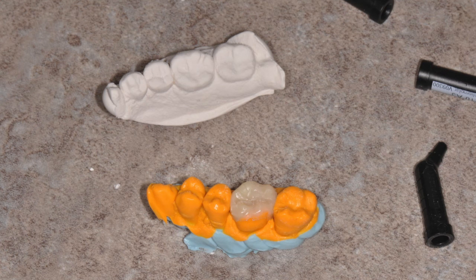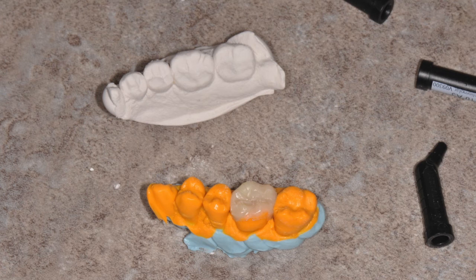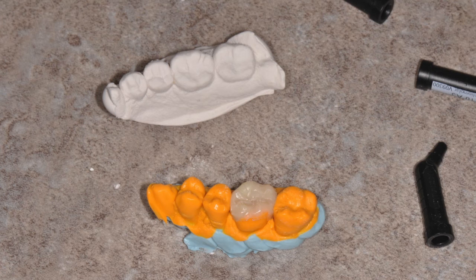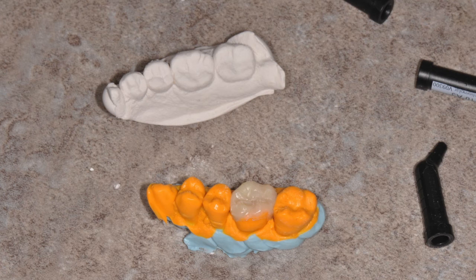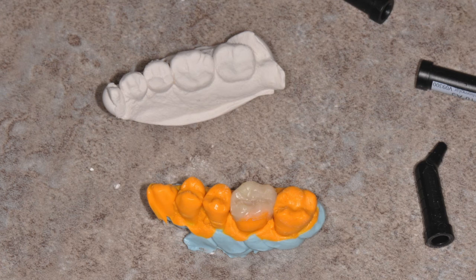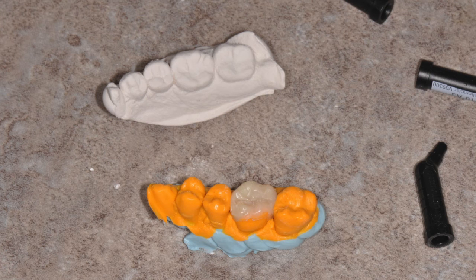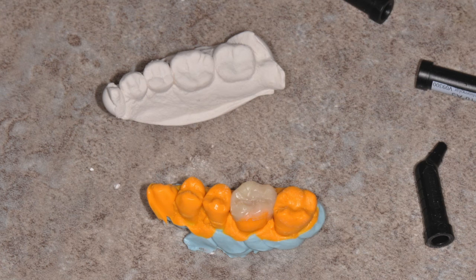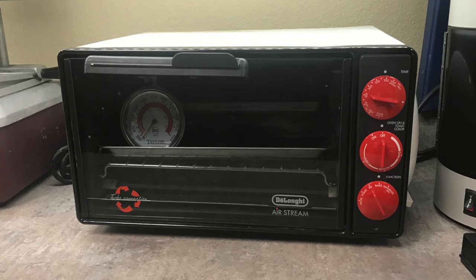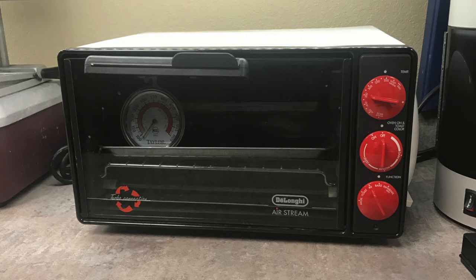A microfill composite, which exhibits great wear properties and flexural strength, is incrementally placed on the silicone die and sculpted to the desired shape and anatomy. The opposing cast can be used to establish the occlusal stops on the composite surface. It is then cured with any light curing unit to initiate polymerization. Once the initial polymerization has been accomplished, the onlay is removed from the silicone die, which is easy to do because it is flexible.